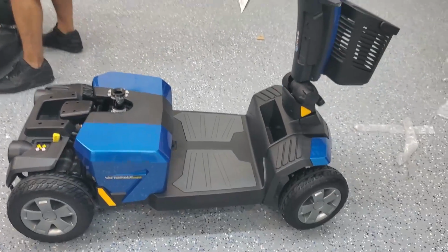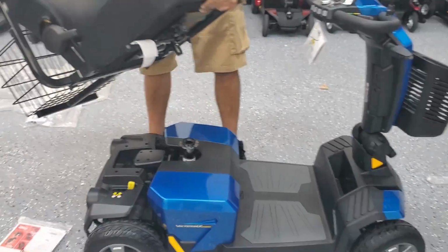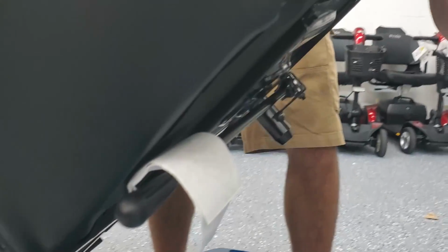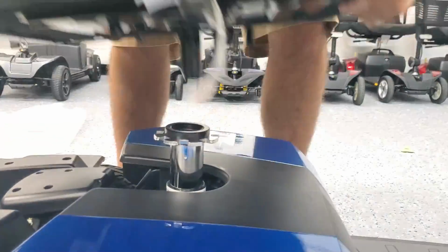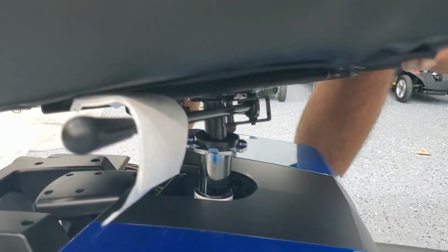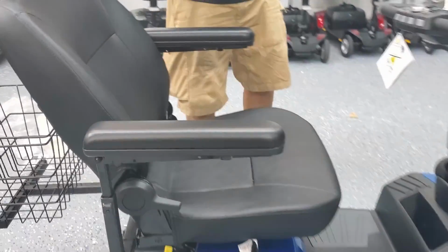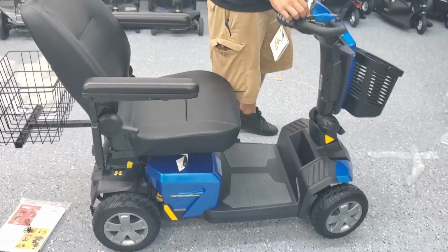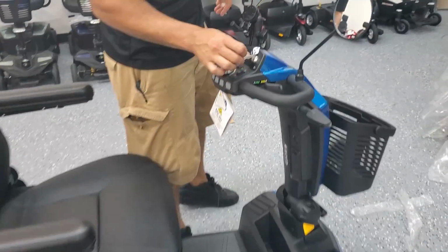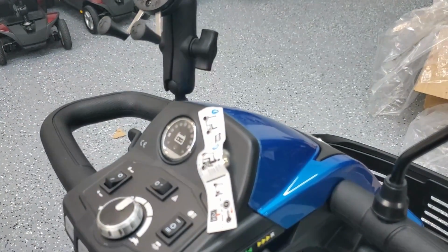I'm going to put the chair back on, which we simply line up the male end with the female receiving end. Might take one or two tries. Once it's in, give it a wiggle. It shouldn't rotate. Now, I'm going to remove the sticker from the ignition key. I'm going to grab the keys.